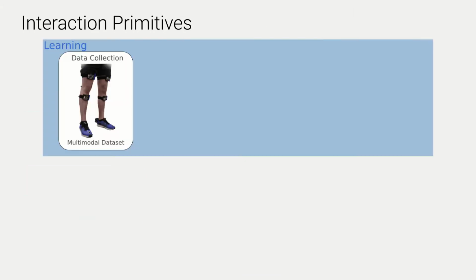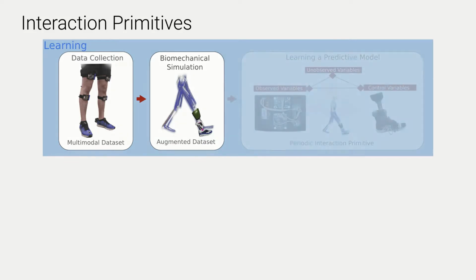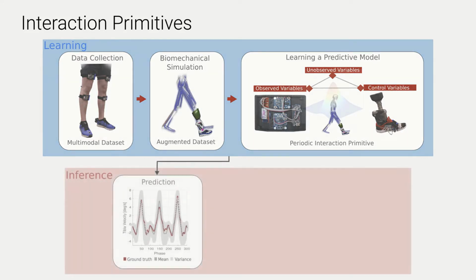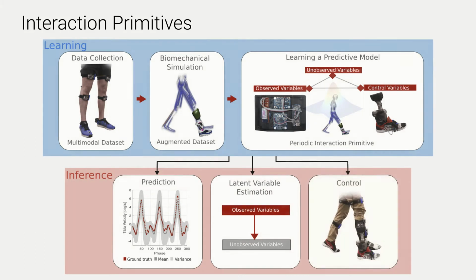within task constraints. The probabilistic model we utilize is called interaction primitives, which is a fast and effective method for human-robot interactions. Our method takes collected sensor data from human demonstrations and, using a state-of-the-art biomechanics simulator, adds computed biomechanical values such as joint angles, forces, and moments. We then learn a Bayesian framework, which generates predictions of the state and action of a subject given the requisite observable sensor values. Once trained, an interaction primitive anticipates the future states of the human user from observed sensors and infers latent unobserved variables such as the internal forces and device control values without the necessity of further biomechanical simulations, a necessity for the use of real-time model predictive control later on.